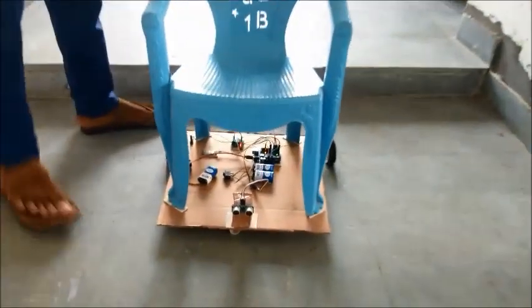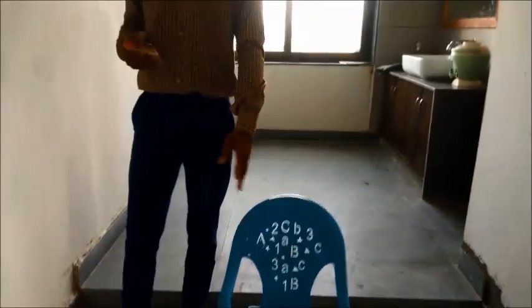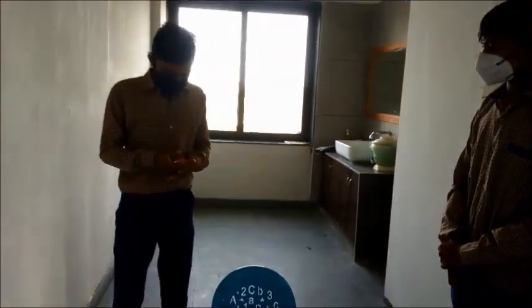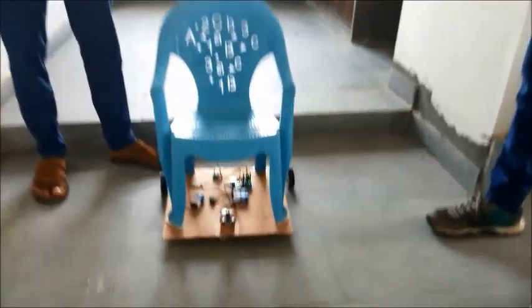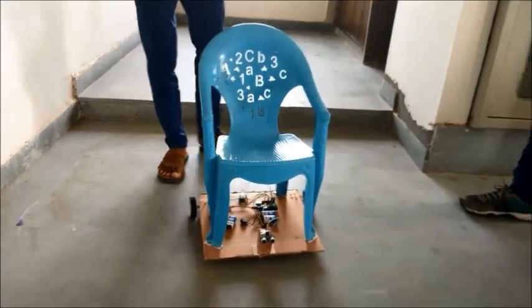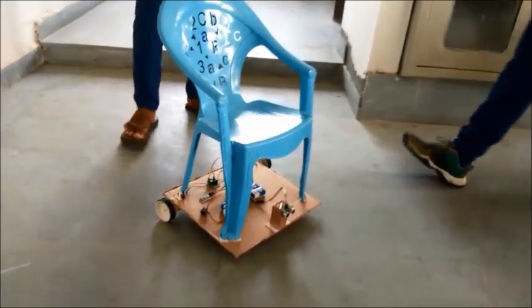Now, when I speak 'forward,' the wheelchair goes in the forward direction. So now we will see the actual working. Forward. We can see that the wheelchair is going in the forward direction. Stop. It has stopped now.